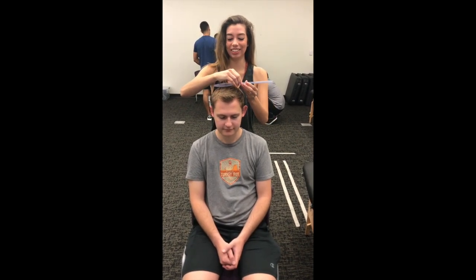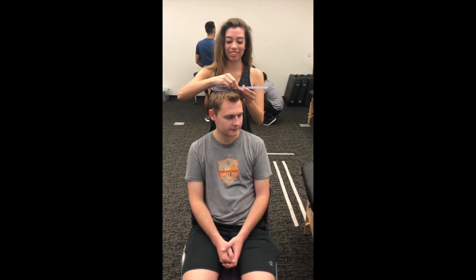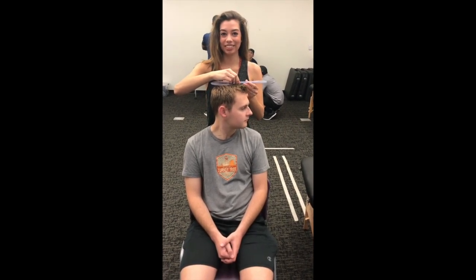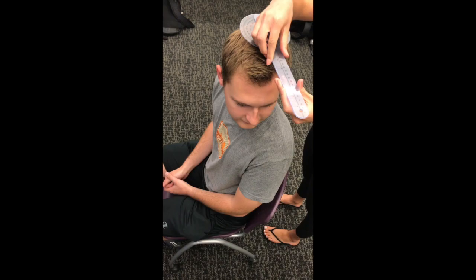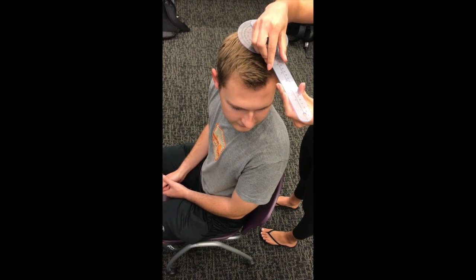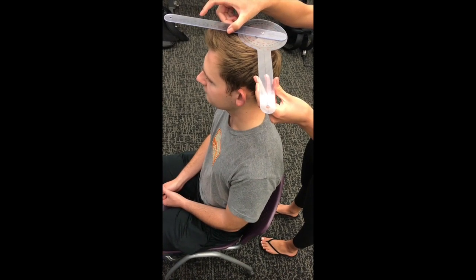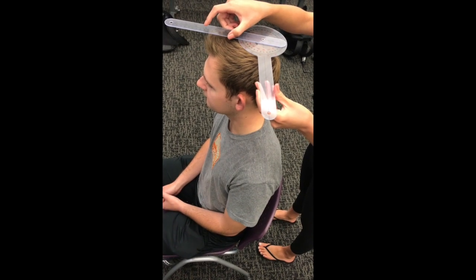Have your partner sit with head in neutral position. The axis of rotation is over the center of the skull. The stationary arm is parallel to the acromion and the mobile arm is the tip of the nose. His measurement for cervical rotation is 85 degrees. Normal range of motion is 80.